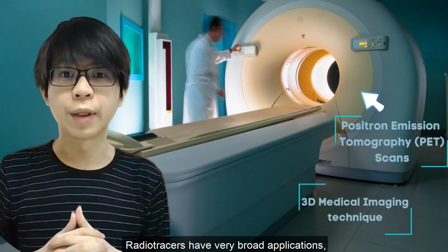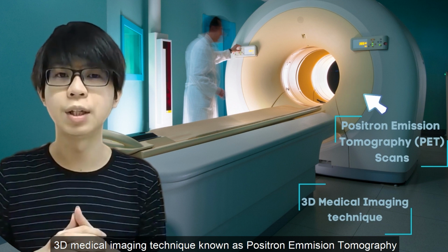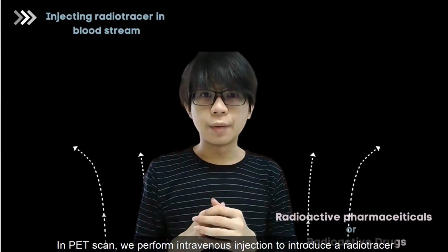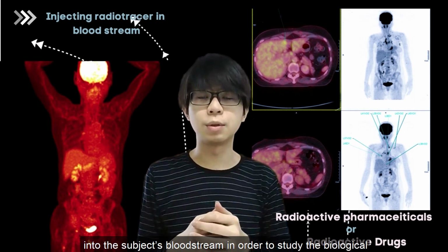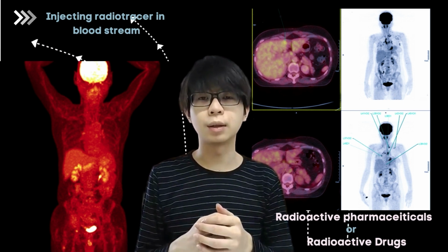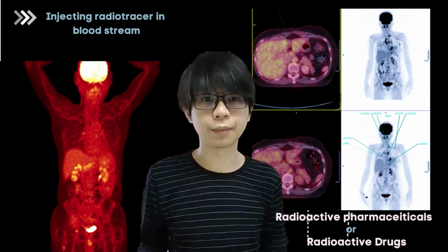Radiotracers have very broad applications, but we are going to focus on how radiotracers provided us with a powerful 3D medical imaging technique known as positron emission tomography (PET) scans. In PET scan, we perform intravenous injection to introduce a radiotracer into the subject's bloodstream in order to study the biological and biochemical processes going on inside the subject. Hence, in this context, they are sometimes called radiopharmaceuticals or radioactive drugs.